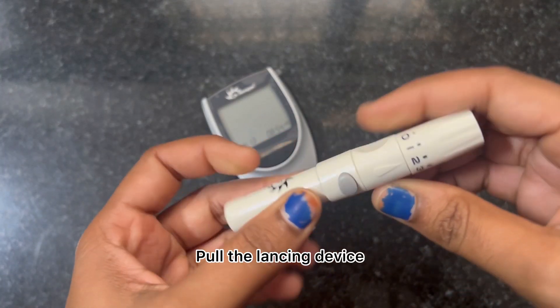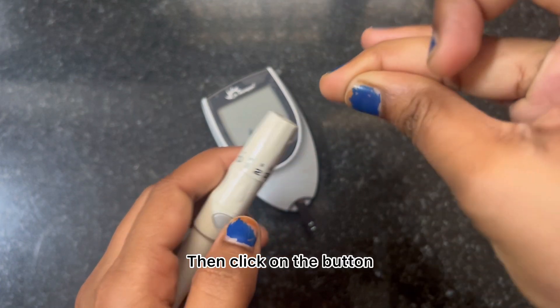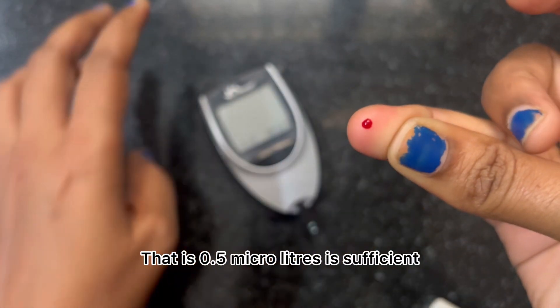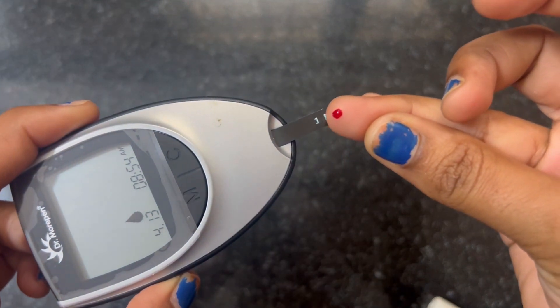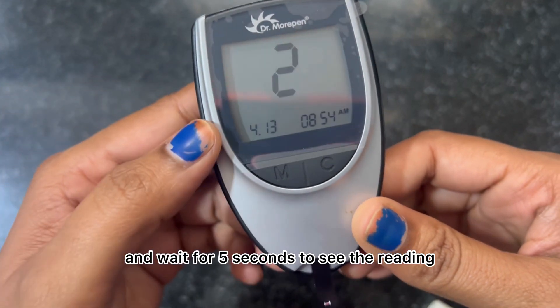Pull back the lancet device and place it on the side of your finger, then click the button to prick. We need only a very small amount of blood — 0.5 microliters is sufficient. Place the blood drop on the other end of the strip and wait for five seconds to see the reading.